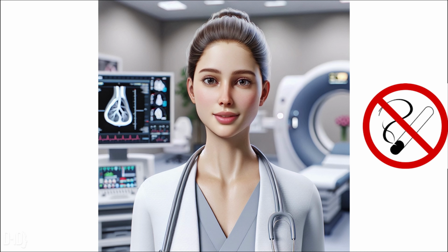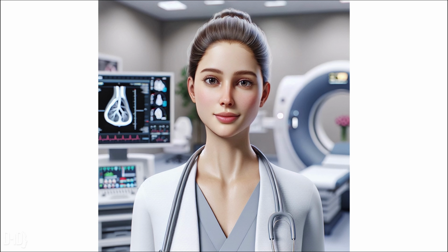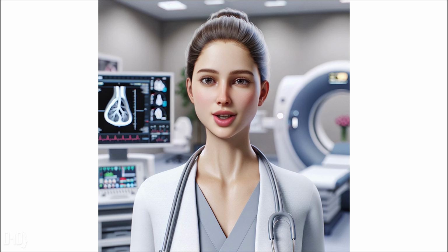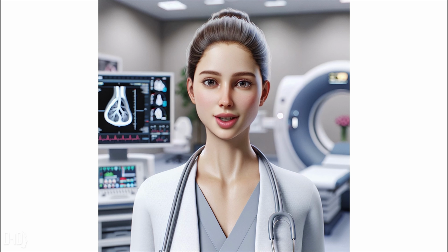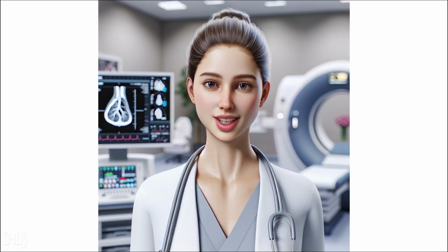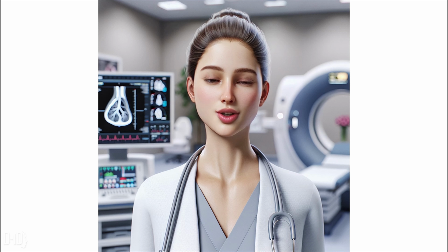of angioplasty. Risks. While generally safe, risks may include bleeding at the catheter insertion site, allergic reactions to the dye used during imaging, blood clots or stent blockage. Rarely, artery damage, heart attack, or stroke.